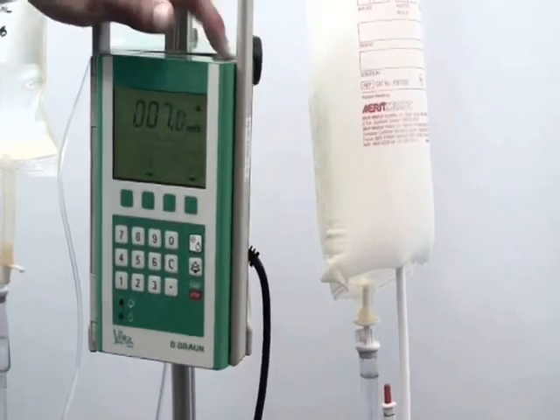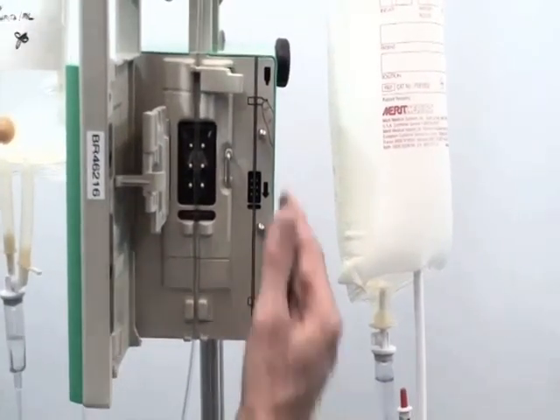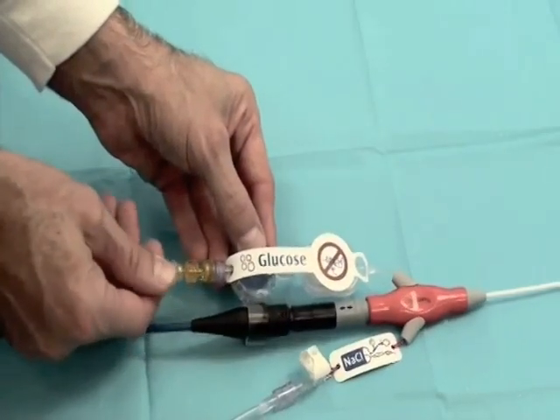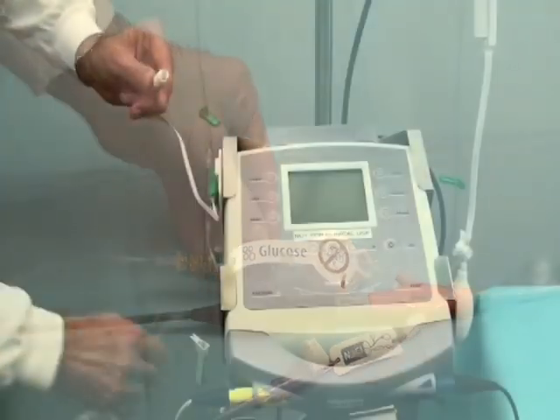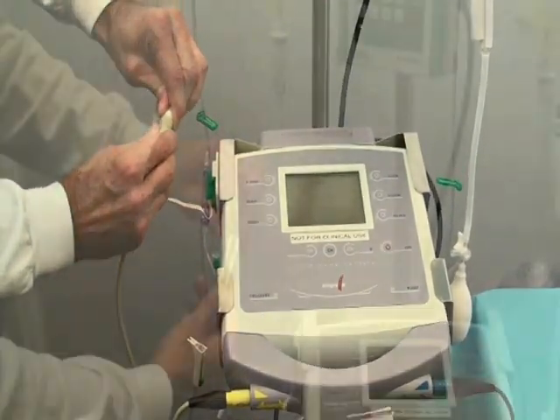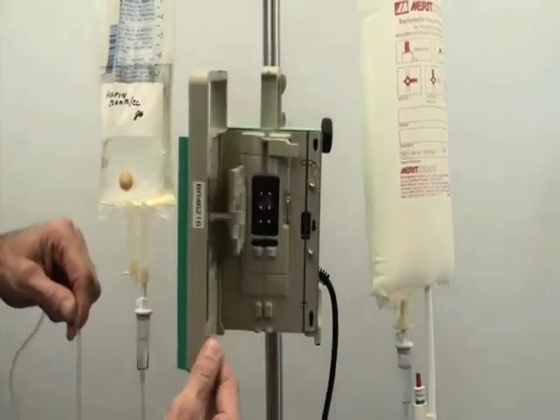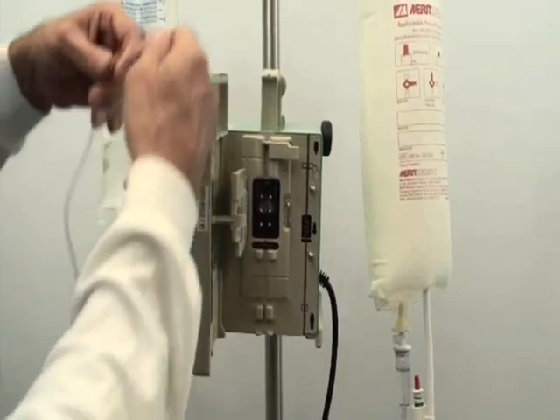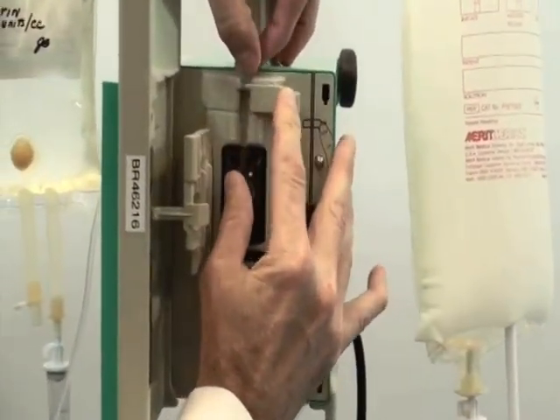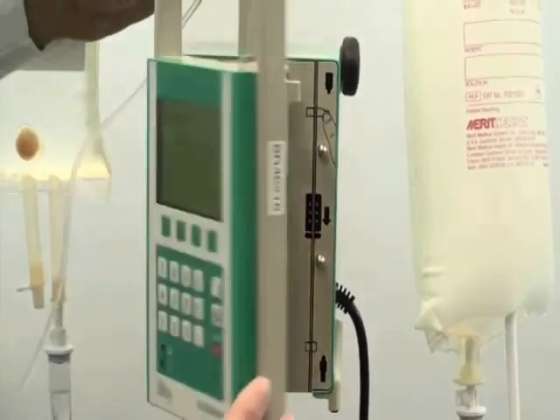Open the door to the infusion pump. Remove the current purge tubing. Connect the new Combitron monitoring set to the catheter at the yellow check valve and the gray pressure cable. Open the roller clamp. Load the new purge tubing into the infusion pump, and close the infusion pump door.